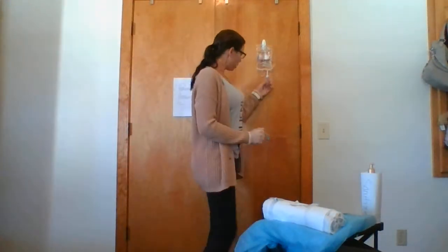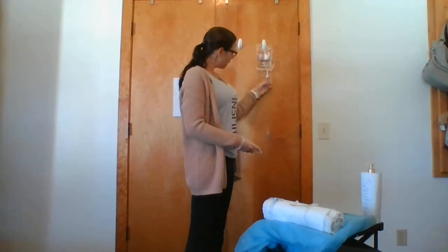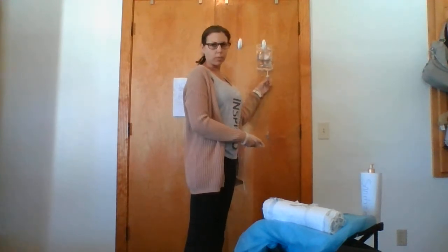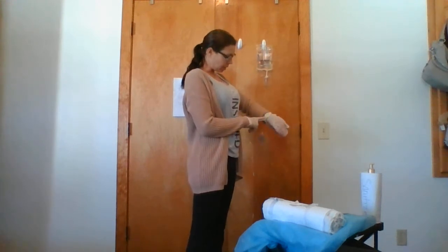Okay. The way you're going to do that is you're going to make sure to advance this slowly until you get to 21 drops a minute in this port. Okay, you do that by utilizing your watch.